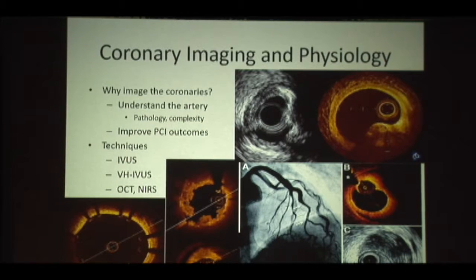If we're going to remain in this business, if we're going to convince Dr. Jessen that PCI is reasonable, then we have got to do a good job. We've got to show good outcomes. As we adopt new stents, new technologies, we have to be able to implant them well because poor implant technique is associated with worse outcomes.